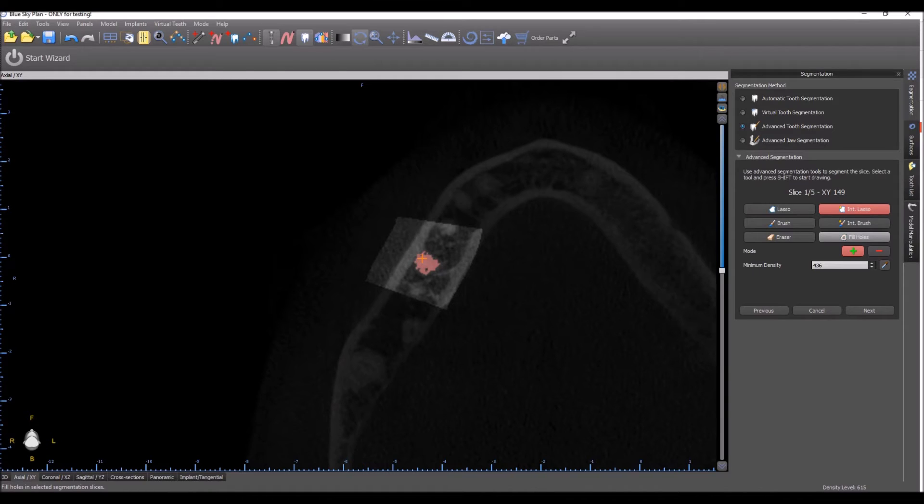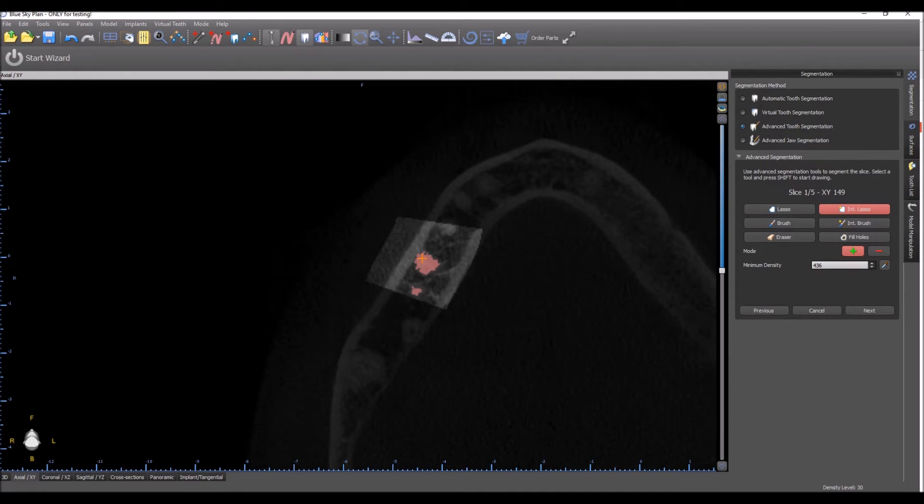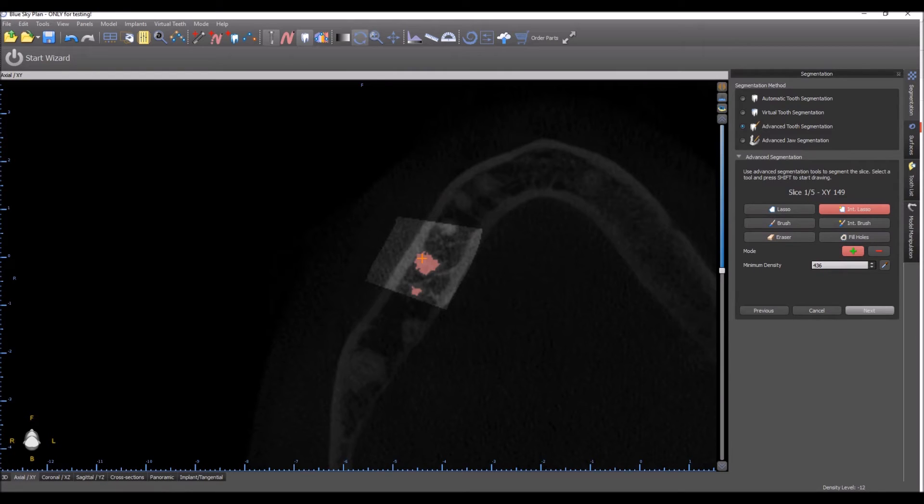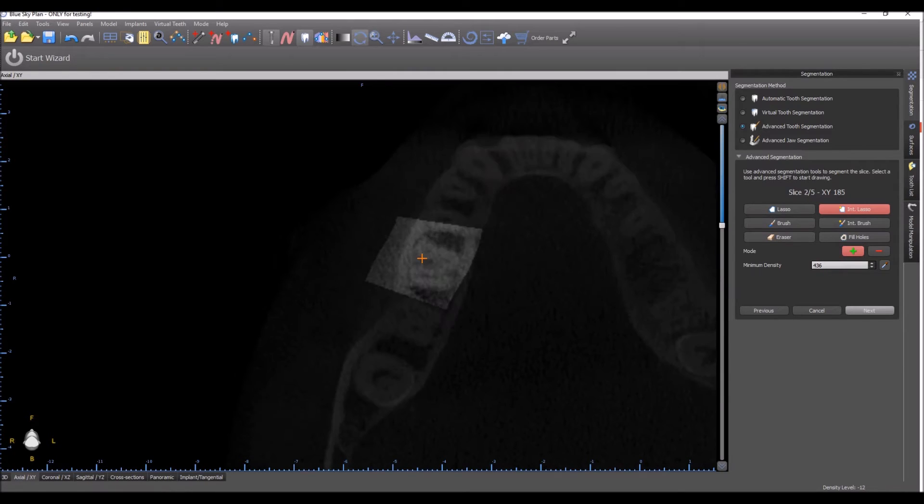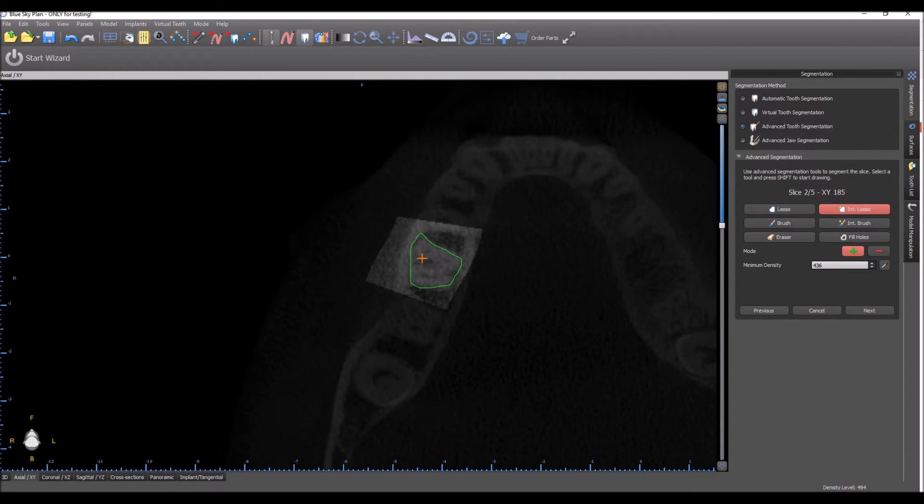Filling Holes will fill in any holes that we have, and we're going to go slice by slice here and select the relevant areas. Move to slice number two.